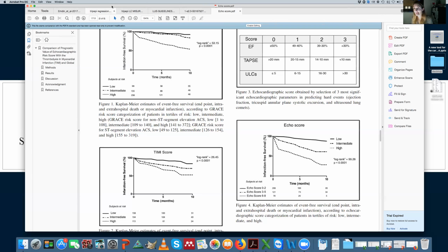Oh yeah, it is exactly the example that I did in the presentation. Absolutely yes, because B lines and the extent of extravascular lung water is not related to ejection fraction. So it is a kind of information that is additional. And as I said, in this typical situation, as you are saying, it is even more useful because it's not so clear that you are expecting B lines. So yes, and it's the same for diagnosis, for monitoring, and also for the prognosis.